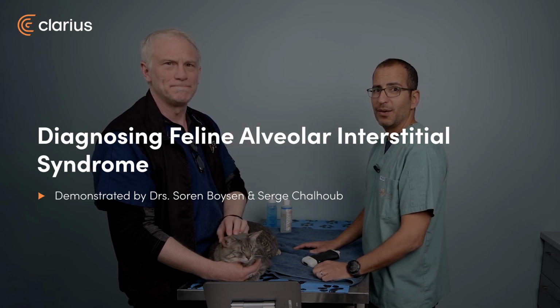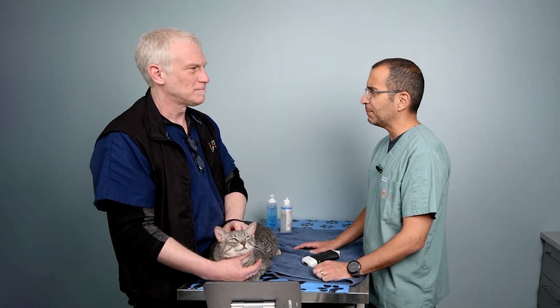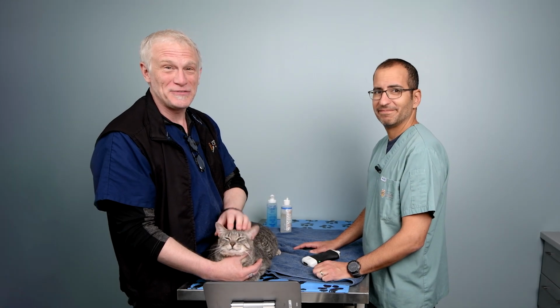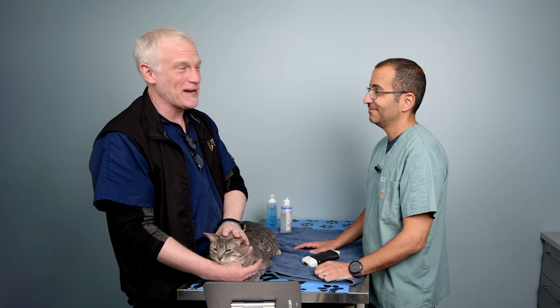And I'm Soren. Hey, wait a minute. Did we just ask the Clarius to mirror the image? Because we are flipped. That is a nice feature on the new Clarius. You can give it voice commands and flip the image. That wasn't intentional, but hey, we're going to go with it. That's okay. This is my better profile anyways.